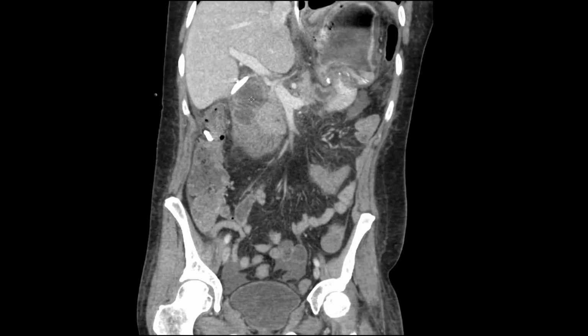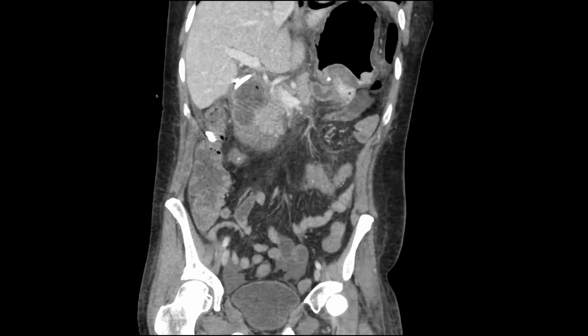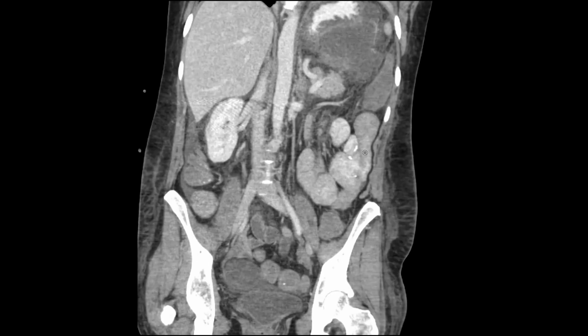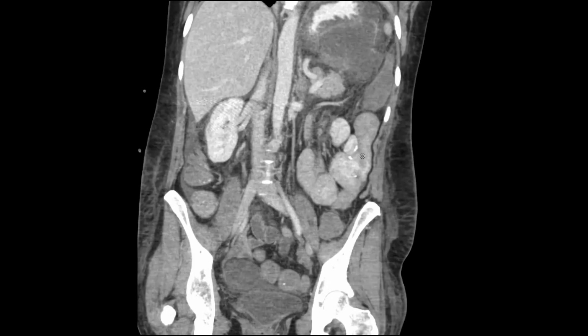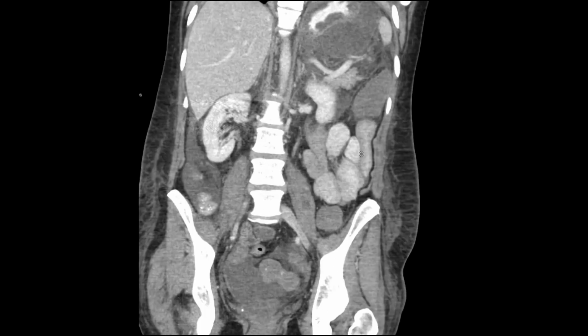Okay, so with the CT scan, we found a whole bunch of stuff that the surgeon never would have known about if we did an upper GI. Okay, CT is truth. CT is the gold standard, and little by little, we will educate our surgeons and get them to start doing more CT scans with oral and IV contrast if necessary. Especially for a leak, you have to do the oral contrast. And we're going to push them in that direction, even if we have to drag them along. So that's all I really wanted to tell you guys about today.